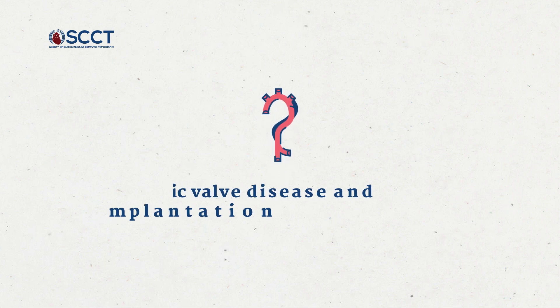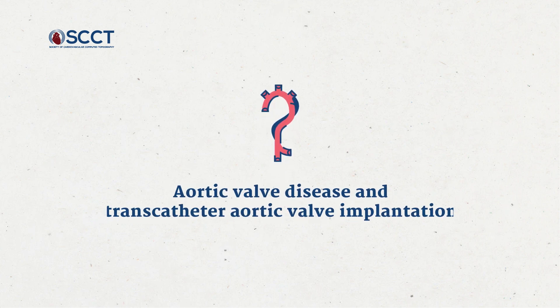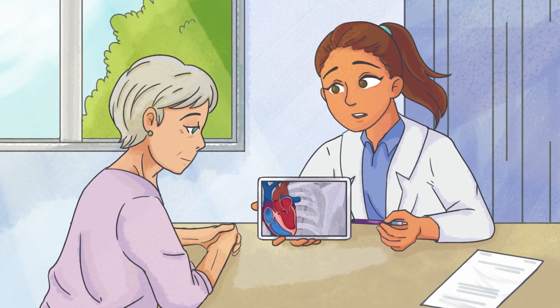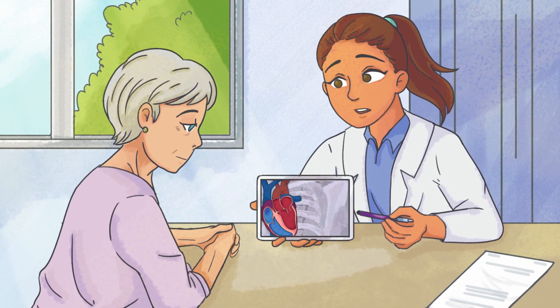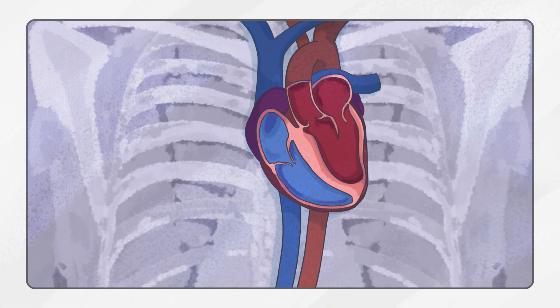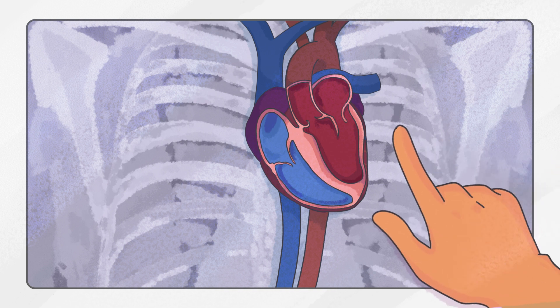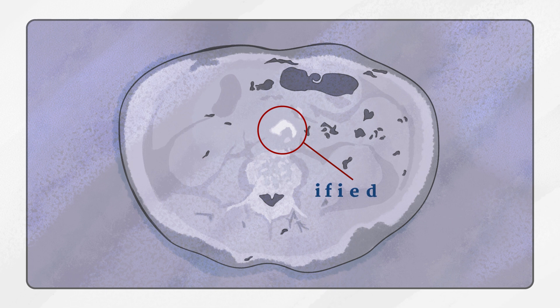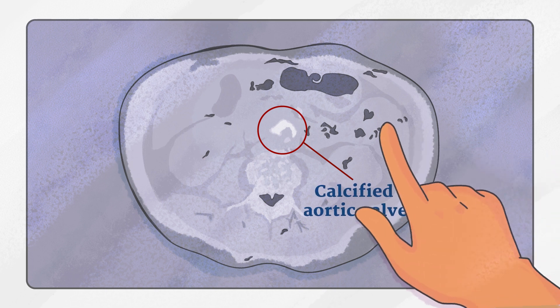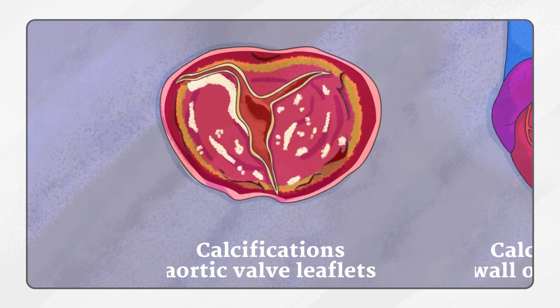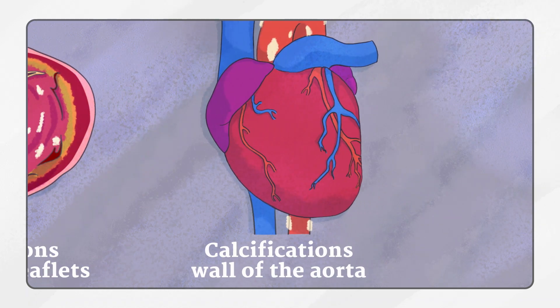Cardiac CT is now routinely used to assess patients with aortic valve disease, particularly prior to transcatheter aortic valve implantation. This is a dedicated CT showing calcifications in the aortic valve and the left ventricular outflow tract. However, regular chest CTs also give you a good view of aortic valve calcification. Here is a regular chest CT and you can see a very calcified aortic valve. By going in the coronal plane you can make sure that these calcifications are on the aortic valve leaflets and not in the wall of the aorta.